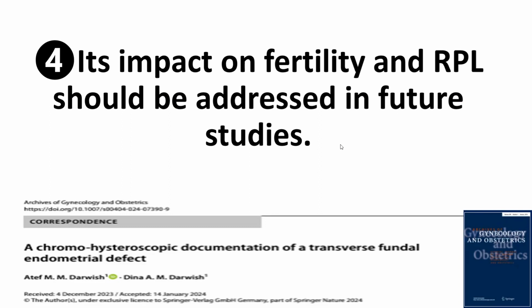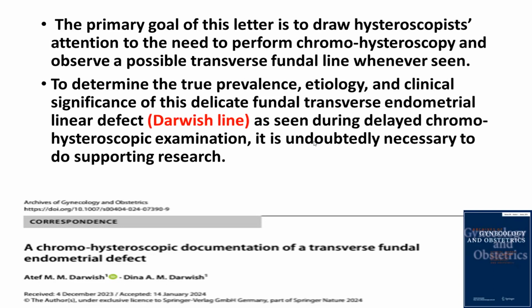Of course, I encourage all interested hysteroscopists to start to focus on this point, to take biopsies, and to discuss this issue with me anytime. The primary goal is to draw the hysteroscopist's attention to the need to perform chromohysteroscopy and observe a possible transverse fundal line whenever seen, and to determine the true prevalence, etiology, and clinical significance of this line. Of course, further research is needed.